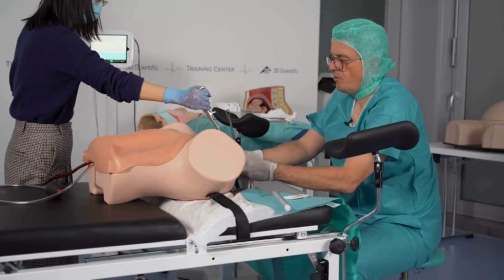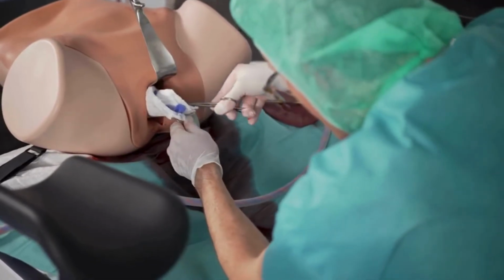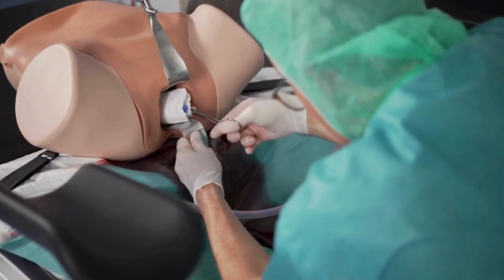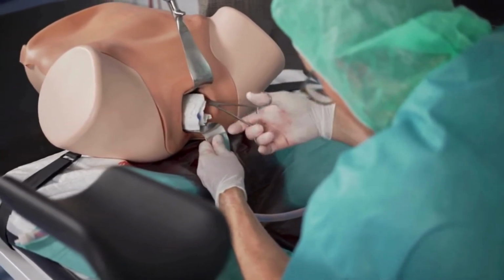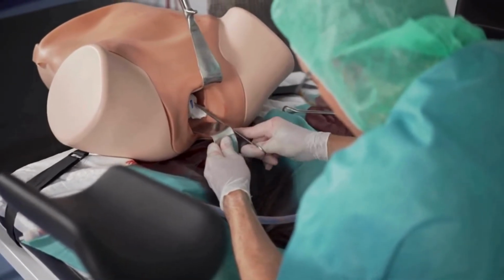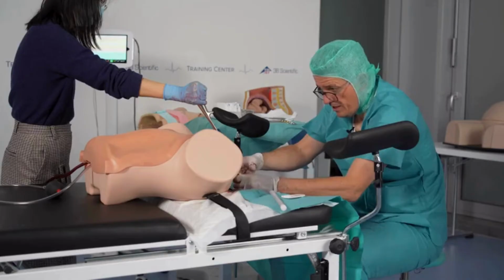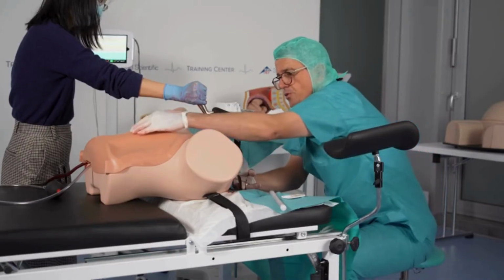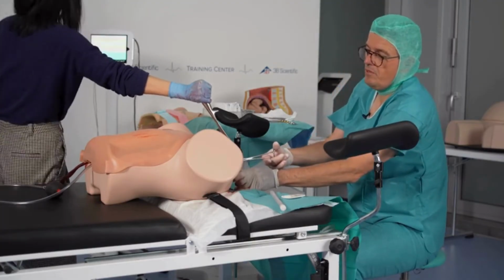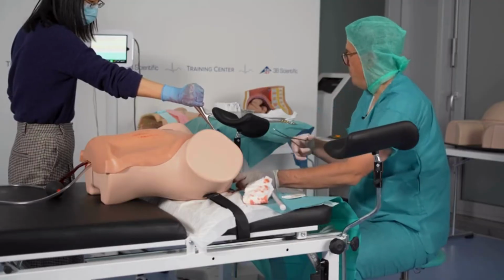Now what you can do, of course, you can do a classic packing, where you can put this gauze into the uterus and into the vagina to put some pressure in the uterine cavity. And then in addition, you can hold the uterus from there and get the bleeding to stop. So that is the easiest way. If it's still bleeding, of course you need to switch to another form of packing.